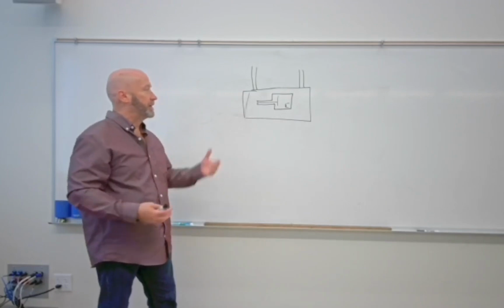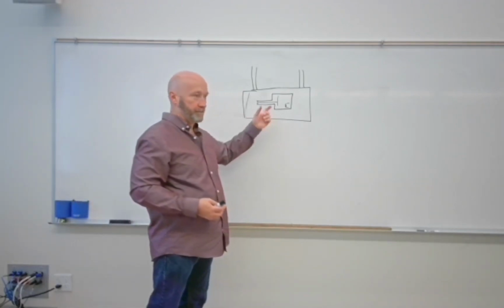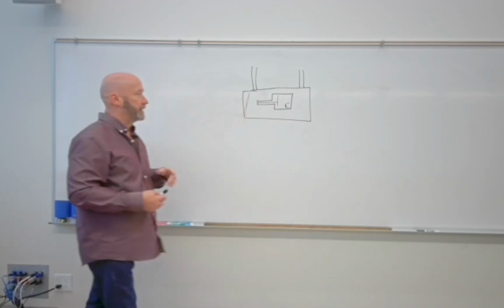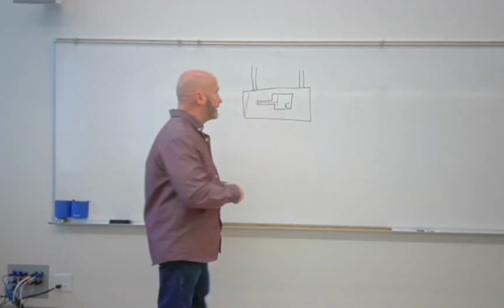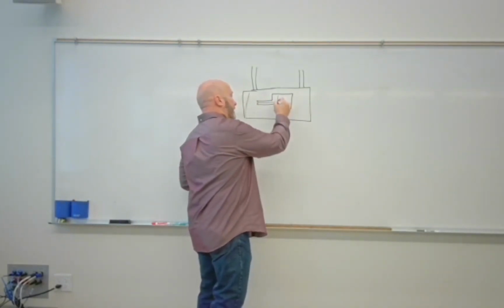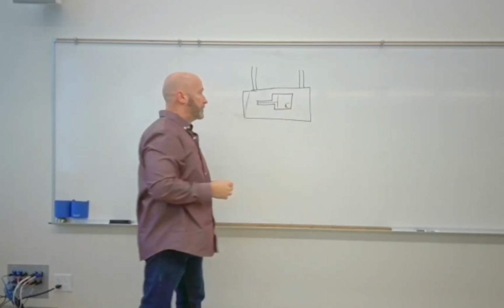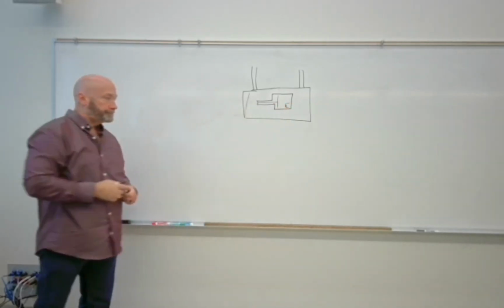So it's just electrons. They're very hot. And that's one of the ways we're going to limit the life of the X-ray tube, creating the heat. We're going to create the heat here. We're going to deposit it over here on the anode. And so we've got heat, right? So we've got to deal with that heat.